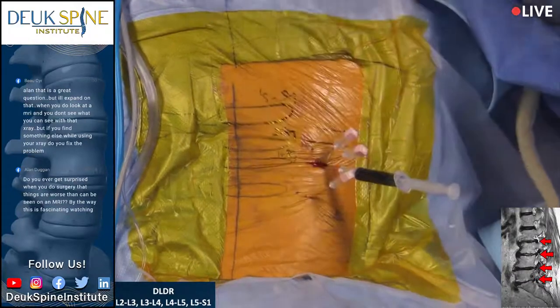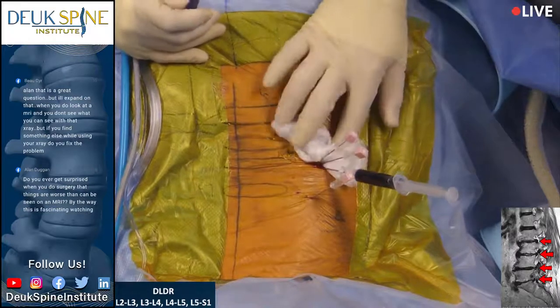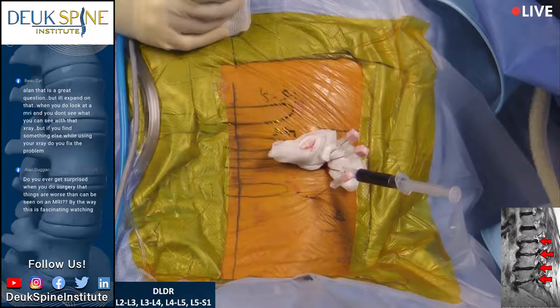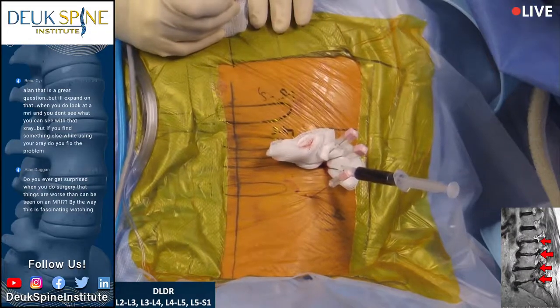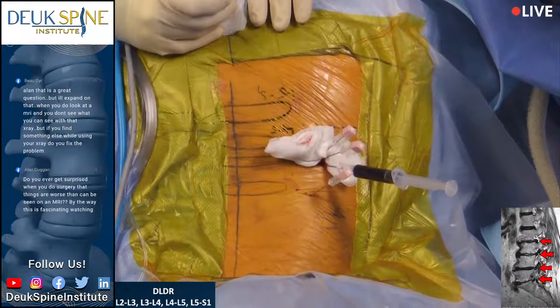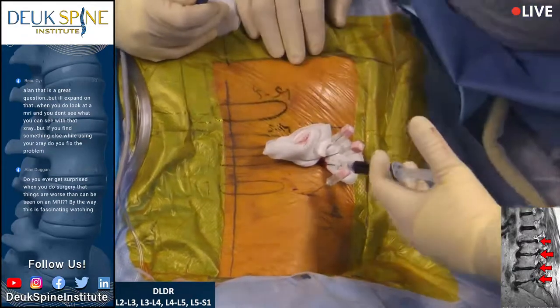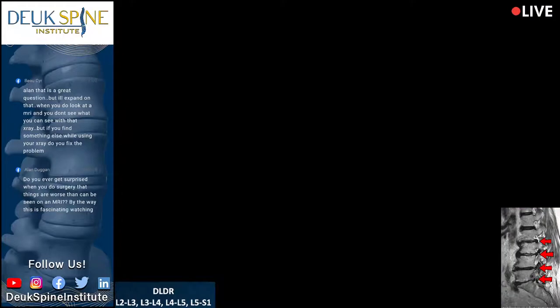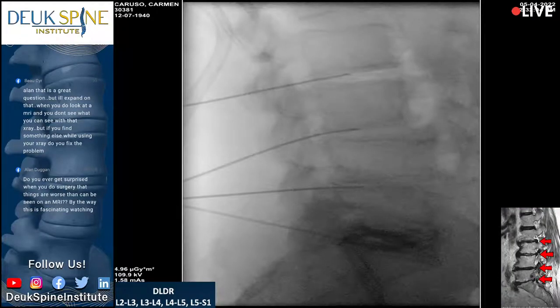And now I'm going to do our discogram and verify that these discs are a source of his pain, and also to stain the degenerated nucleus blue. Are you comfortable? You doing all right? All right, good. Lay still. Don't move. How bad is that on a scale of 1 to 10? What's the highest it went? 9. Is that where you get your back pain? Yes. So that's a 9 over 10 at L5-S1. L5-S1 is definitely a cause of his daily pain.